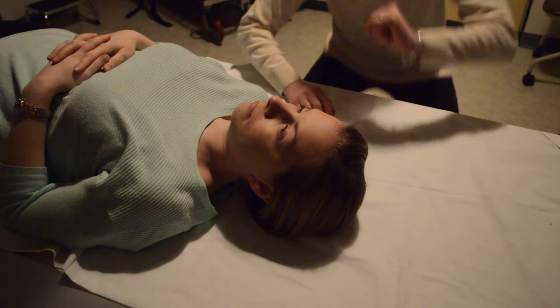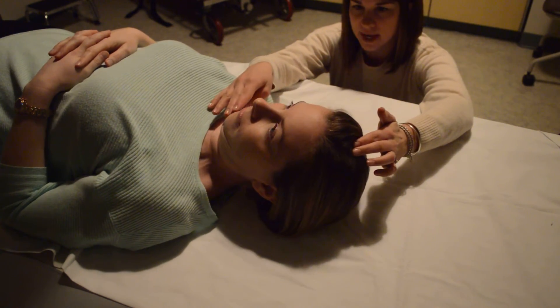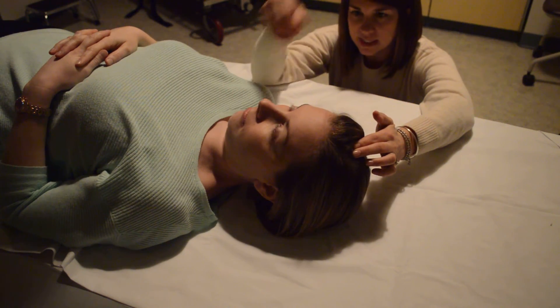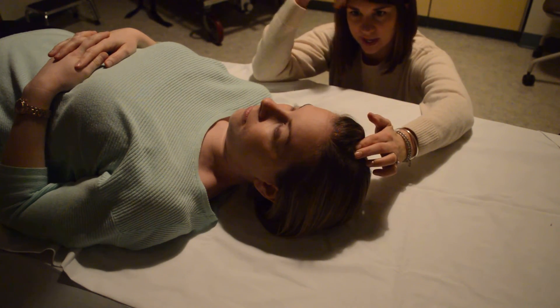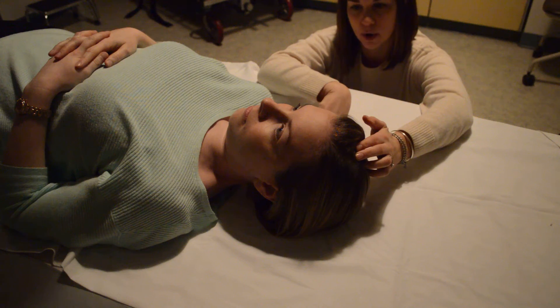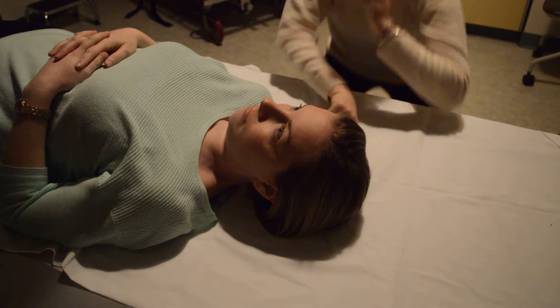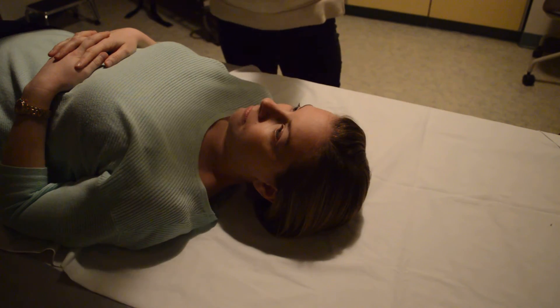I'm going to have Libby tuck her chin for me. Libby is able to tuck her chin sufficiently that that line is perpendicular to the table, so I know I can use a 30-degree caudal tilt.